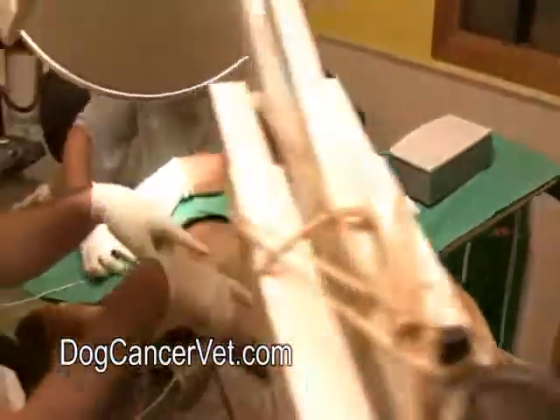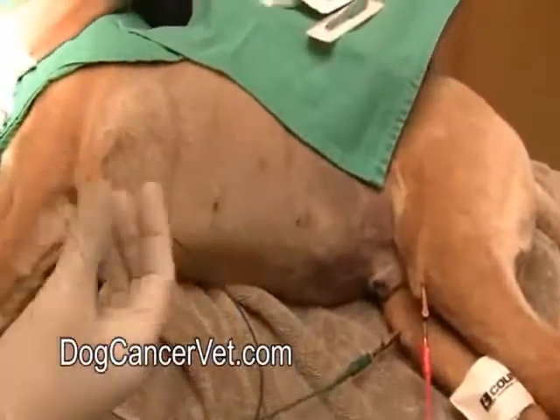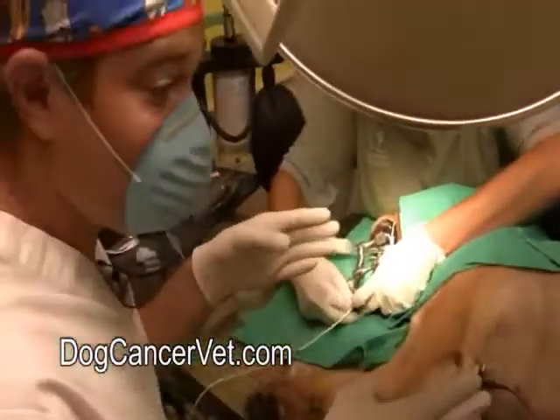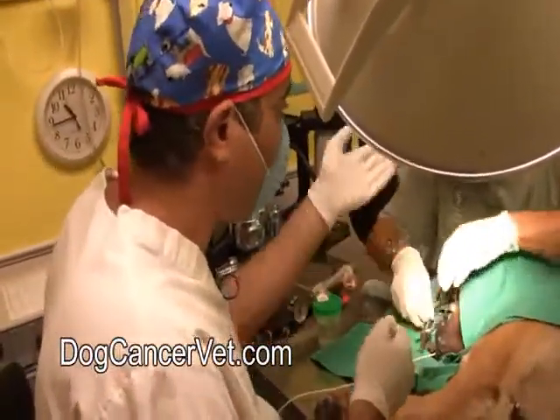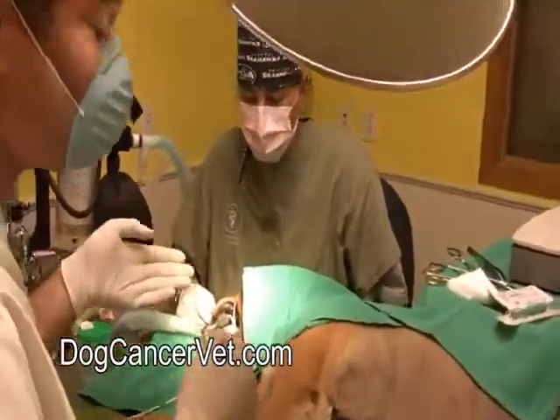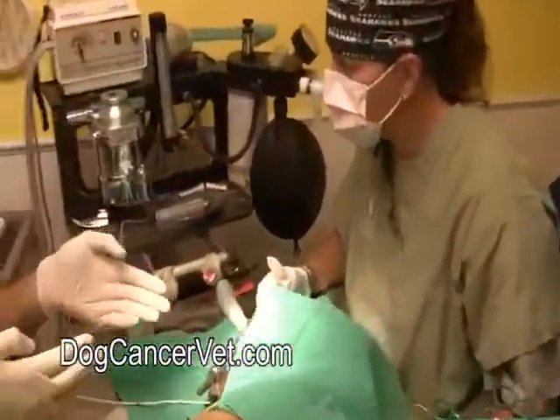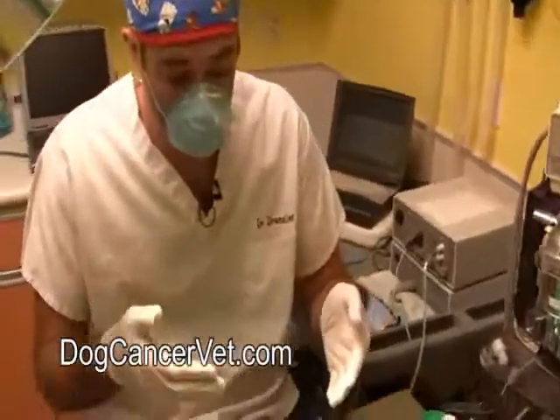We're monitoring his respiratory rate - you can see him breathe right there. This is how we do monitoring when we're doing surgical anesthesia to make sure that the animals are all safe. You want to make sure that all of these things are dealt with so that nothing gets forgotten about while we're doing surgery. Karen's my nurse here and she's going to be helping me monitor all these things. The surgery is a small one and it's going to be pretty quick. It's non-sterile because the inside of the mouth is a dirty area, so we don't have to worry about keeping a sterile field because it's impossible to sterilize this area.